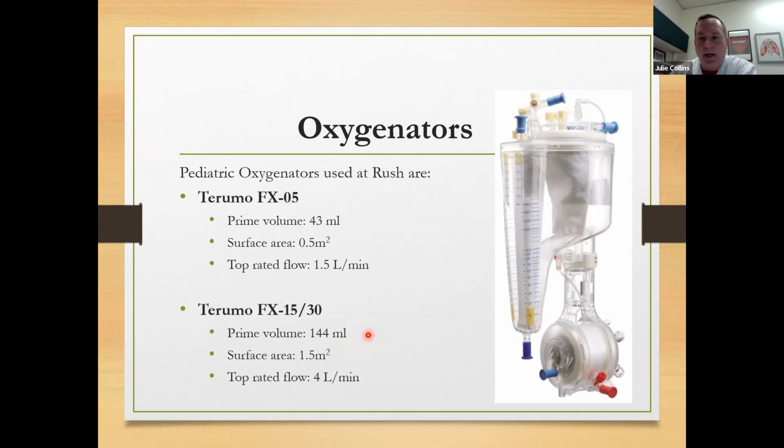Even though you're compromising in terms of hemodiluting more, you never want to be in a situation where your oxygenator does not have the horsepower it needs to accomplish what you're trying to do. You never want to be up at 100% FiO2, have your sweep maxed, and still be under oxygenating a patient. That's a scary scenario as a perfusionist. And that's when you're kicking yourself: I should have picked the larger oxygenator.